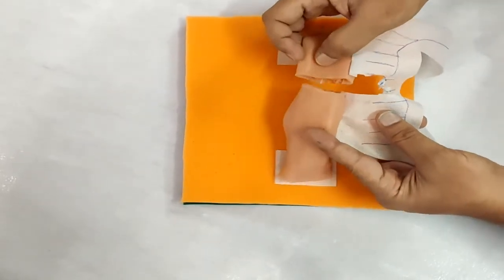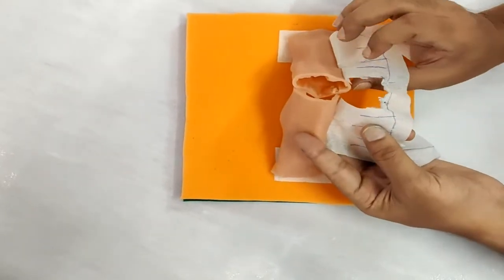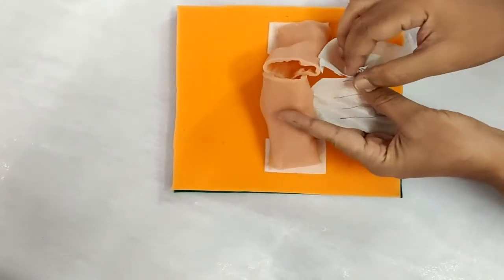After suturing the bowel or anastomosis of the bowel, we need to make sure that we are closing the rent in the mesentery as well. This is an important part, otherwise it could lead to herniation of the bowel.